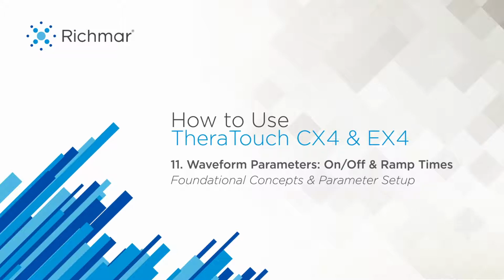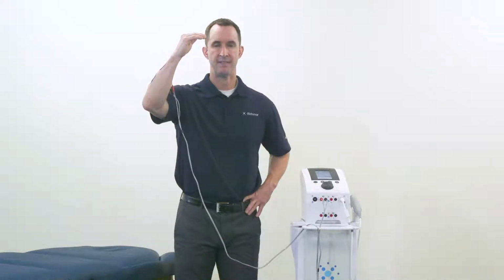Your on-off time in electrotherapy refers to the amount of time in seconds that you spend at the set amplitude or milliamps, and the off time is the amount of time in seconds that you spend with the amplitude or milliamps off, or what's referred to as a rest period.